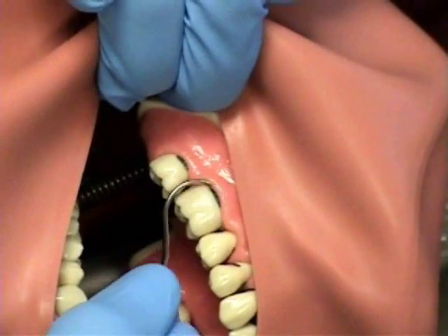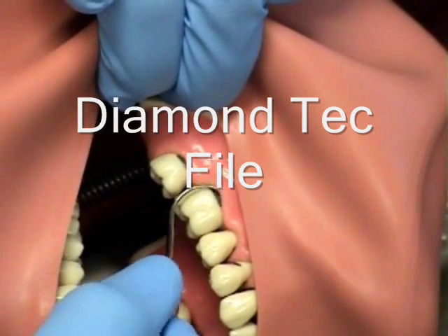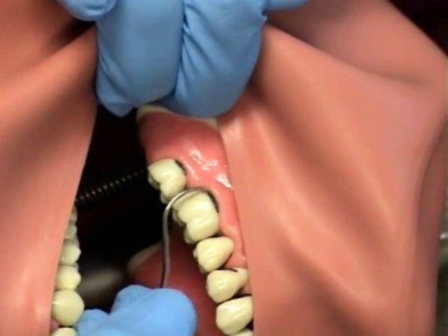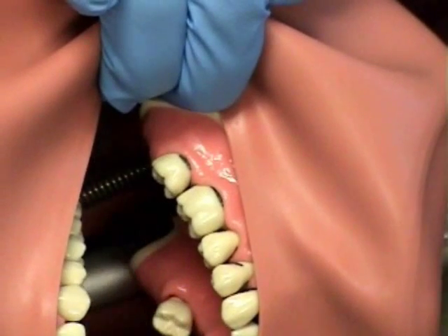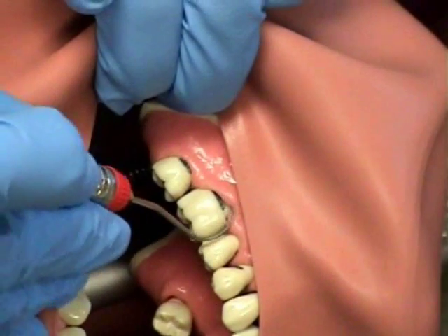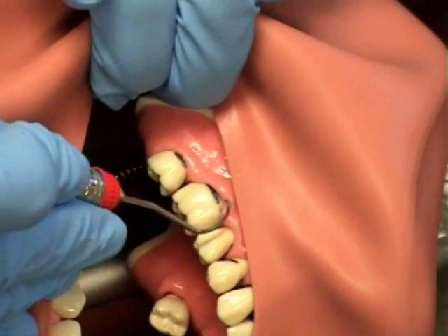With a very difficult deposit, oftentimes a Diamond-Tech file would be the instrument of choice. It is a file with 360-degree diamond coating. It has a thin tip and a unique bend. You activate it with both a push and a pull motion. The benefits of this are that you can have some scaling efficiency and superior access to very difficult to reach, small, narrow pockets.